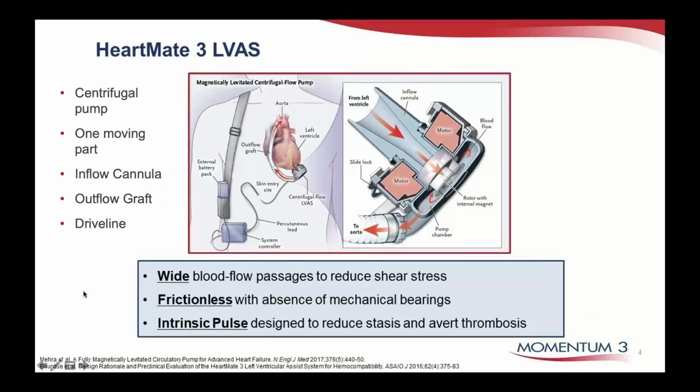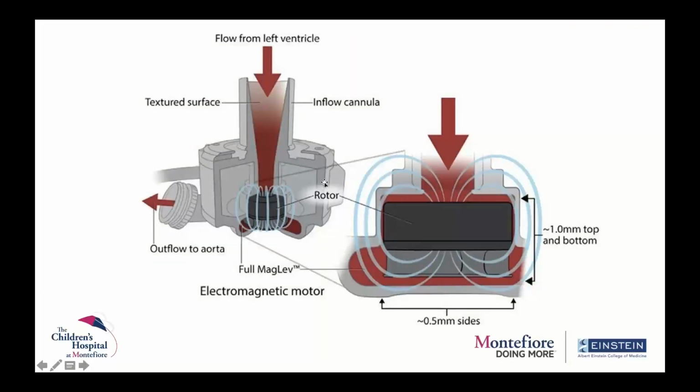Now let's talk about the newest kid on the block, the HeartMate 3. Again, this is a centrifugal pump, just like the HeartWare, the one that I discussed before. It has one moving part, an inflow cannula, an outflow graft and a driveline, just like the previous one. Let me show you a quick video which will help explain how this device works.